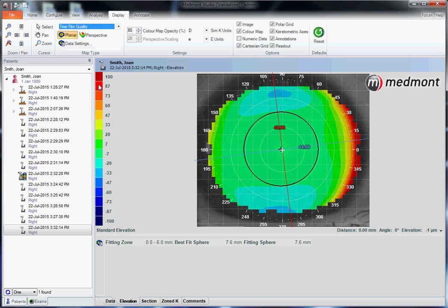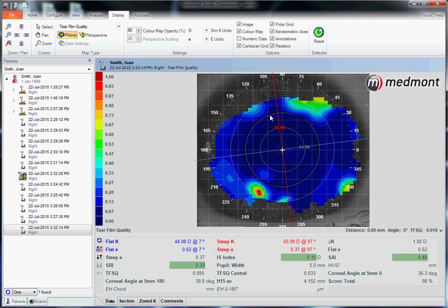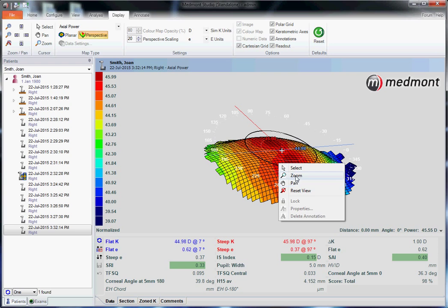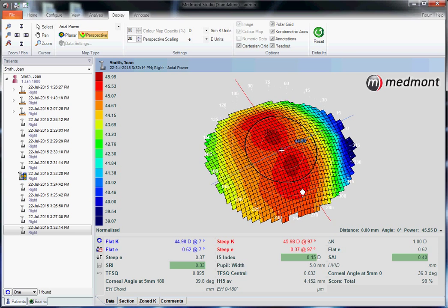We could look at the tear film quality and see that this patient's central tear film quality looks pretty good. The dark blue area within the center is very consistent — the darker the blue, the better the quality of the tear film, and the hotter the colors, the more likely you have tear film breakup. We can use the display window to assess the topography multiple different ways, and even put it into a 3D perspective to understand that eye a different way.